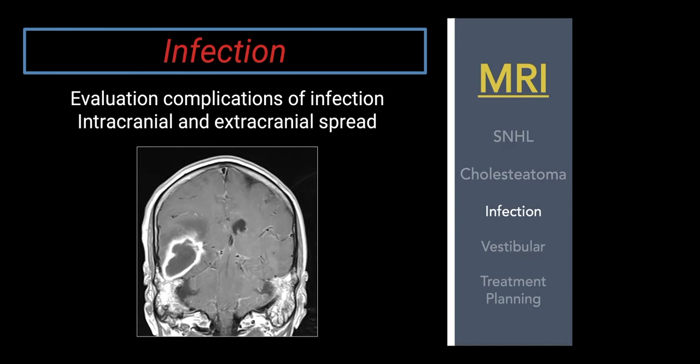For infection on MRI: we already covered coalescent mastoiditis on CT. If there's no coalescence, how do you know something's infected? On imaging, I look for signs of infection outside the temporal bone. Here's a case with a giant temporal lobe abscess extending up from a completely opacified mastoid. Just looking at the mastoid alone, I couldn't say it's infected, but with an abscess sitting on top of it, that confirms the diagnosis.